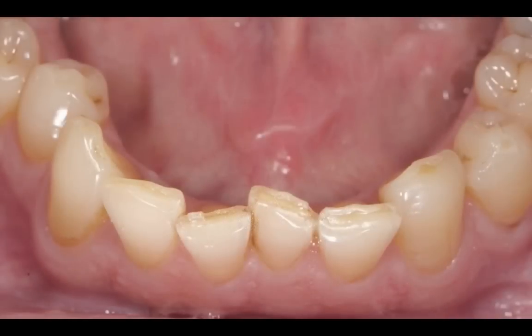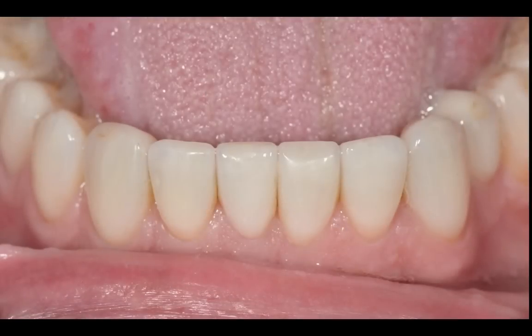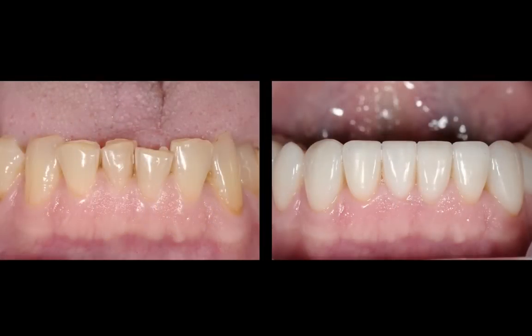And that's basically the case. Here is another view, a slightly open view. And here's a view where I have the before and after frontal views — you can see the before picture, the after picture, and how much improvement we've had with the actual final result.